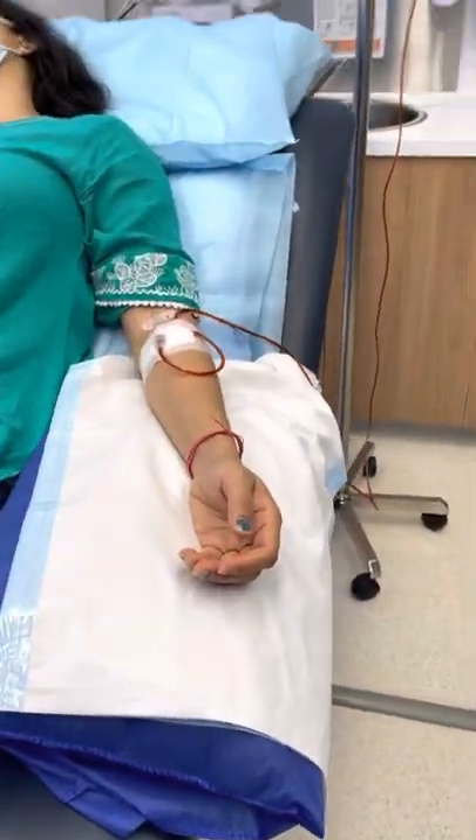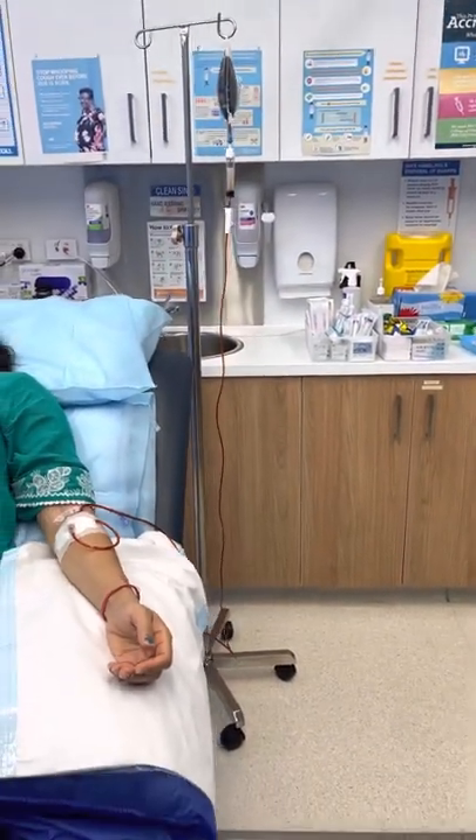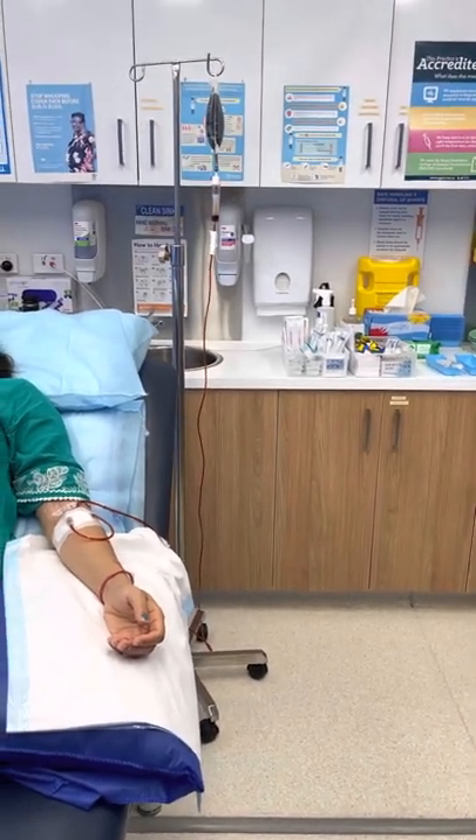It is infusing into her left arm over a period of 20 to 30 minutes. So this is just an introduction to how people have iron infusion. Thank you very much for watching this video.